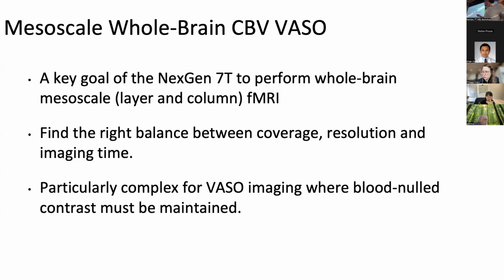And then quickly pivoting to whole brain CBV VASO, which is a key goal of the NexGen 7T.